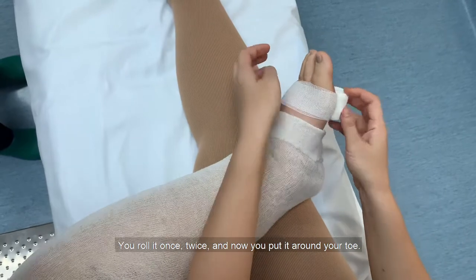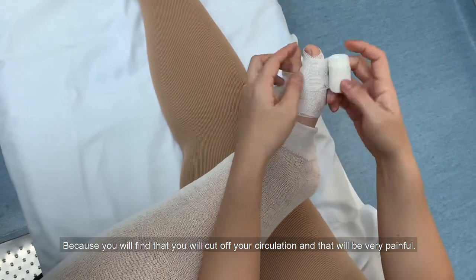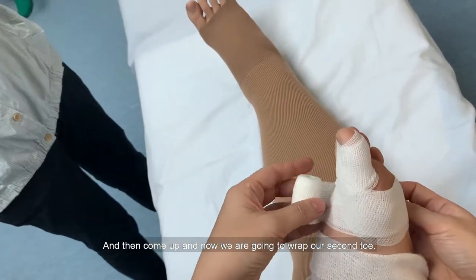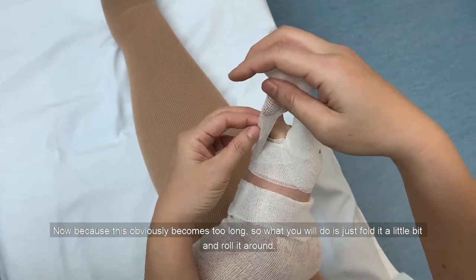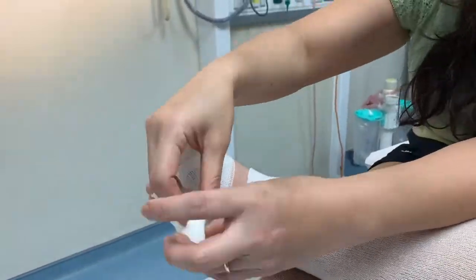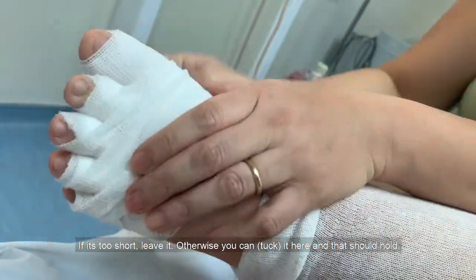Roll it once, twice, and now put it around your toe. Ensure that you do not pull and tuck on it to make it very tight because you'll find that it will cut off your circulation and it will be very painful. Roll it three times, ensure it's on top, roll it behind at the back and then come up. Now we're going to wrap the second little toe. Because the bandage becomes too long, just fold it a little bit and roll it around. If it's too short, just leave it — it should hold.